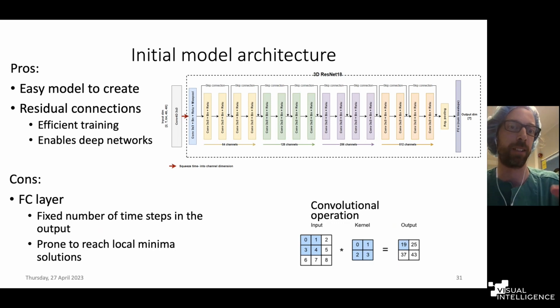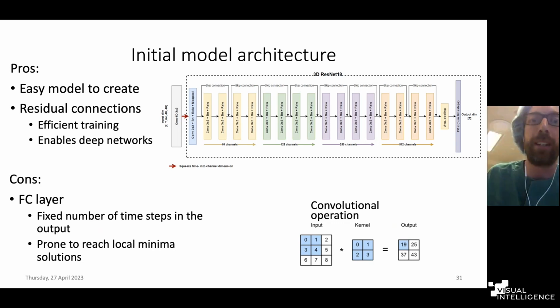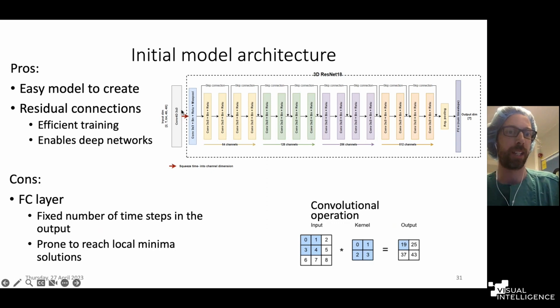But we have also done some deep learning work on the retrospective data. And this was actually presented by our master student, Fredrik Aspheim, yesterday at a conference in Bergen. The deep learning models, if you remember the slide where I showed the transformation from the images down to the input function.